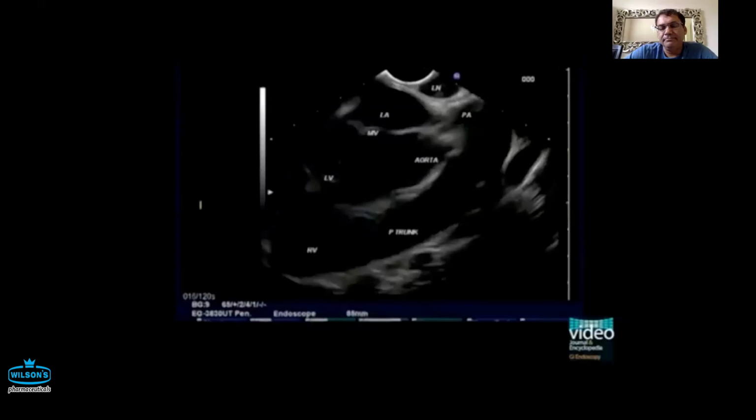I couldn't agree with you more. I think you have to be very careful when you're intubating, even when you're using Olympus scopes, especially in the early stages. In our courses we tell people please don't use the word push. We advance the scope, which means if you have resistance, you do not. Pushing is advancing the scope against resistance, which should not be done in any endoscopic procedure, but especially with the hard tipped and thick EUS scope, the risk obviously increases.